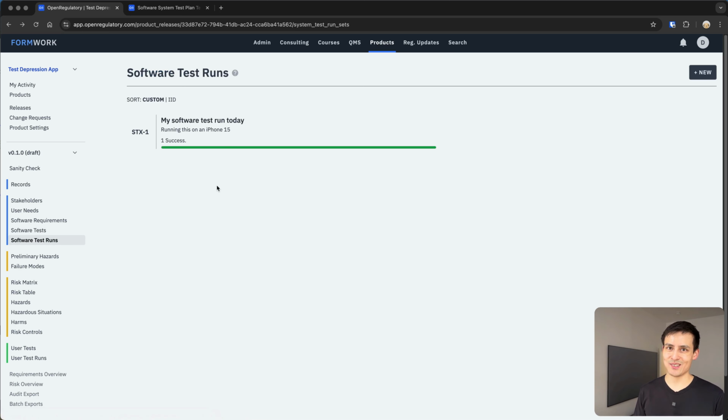Now, there are actually two questions we can get into. The first one, which you probably have, is: okay, can we automate this? And the second one probably is, have we actually covered all of the 62304 things we looked at? Because we just looked at all these super clunky things with integration testing and verification, all that stuff. So in order, can you automate testing?